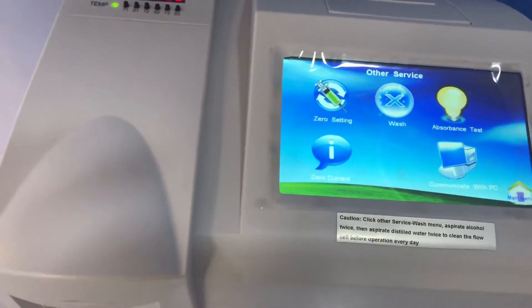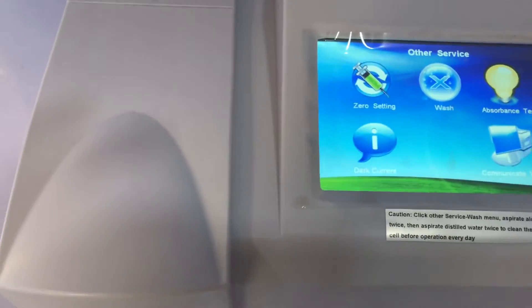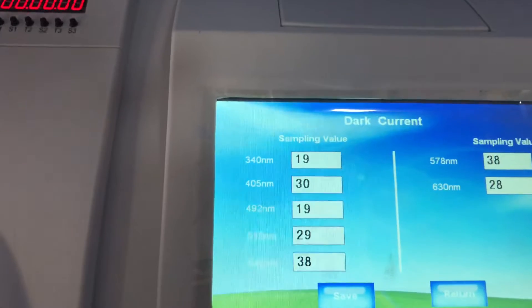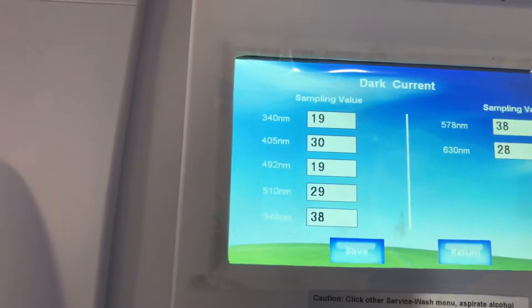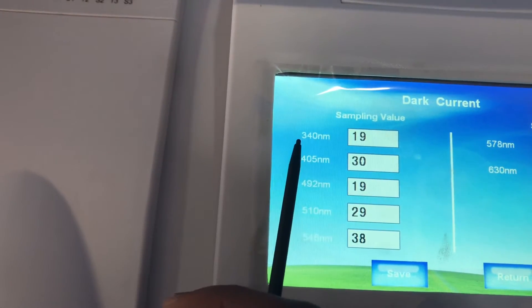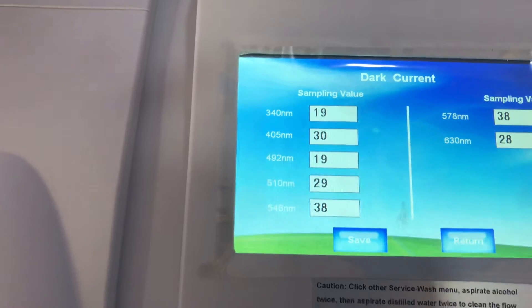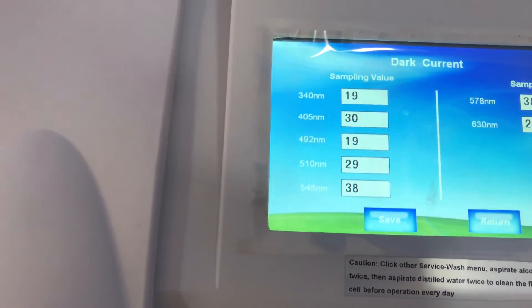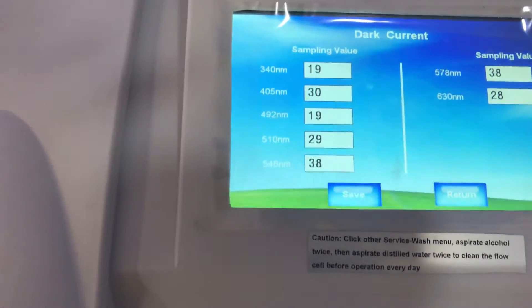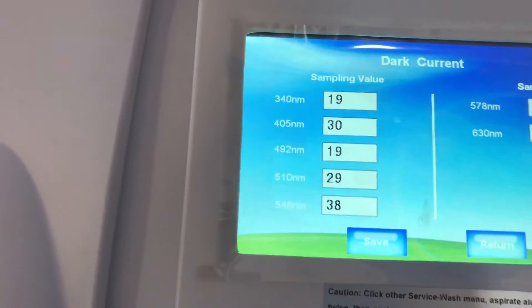Click Return once the washing is done — this washing is a prerequisite when you start your daily work. Then you can do your Dark Current measurement. Click on Dark Current and it will begin to measure the dark current for all the different wavelengths, from 340 nanometers up to 630 nanometers. The values should be in the range of 10 to 50. If they are above or below that range, there is a problem that needs to be addressed.